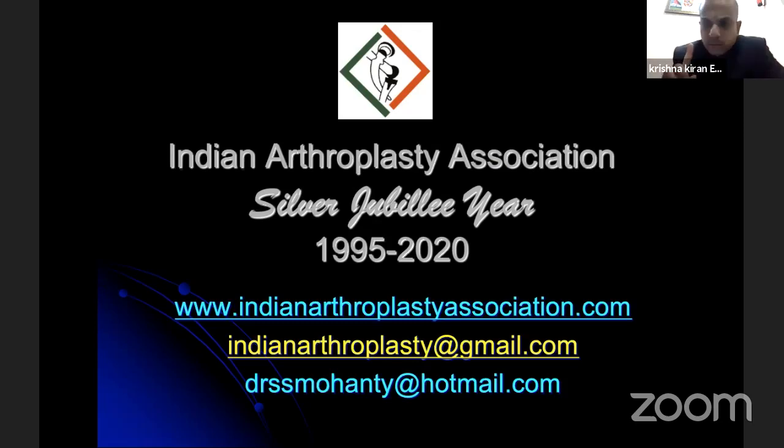I have a comment to make. Actually, two comments. Is peroneal nerve palsy more common if we have medial laxity, which we are trying to address by over-lengthening the lateral structures? Yeah, that's one point. So is there any role of medial tightening rather than over-lengthening beyond a particular polyethylene thickness? That is one we should consider.